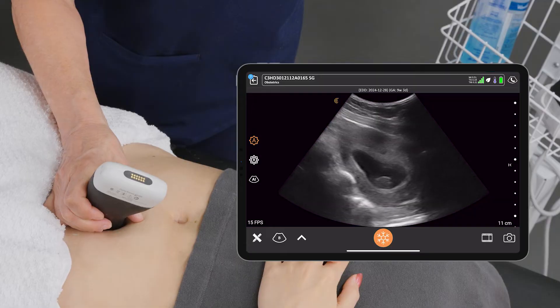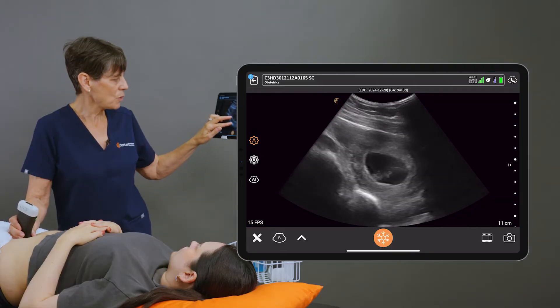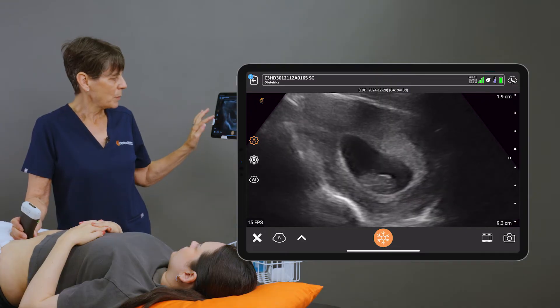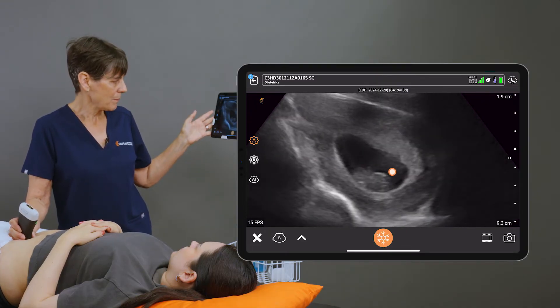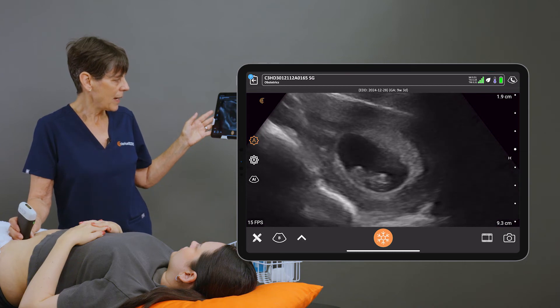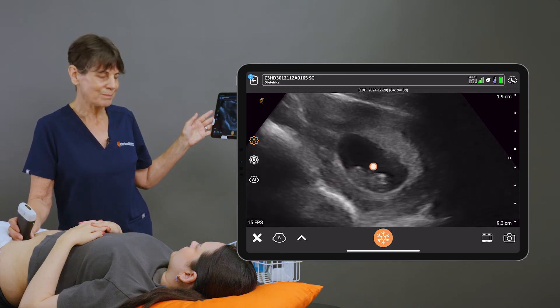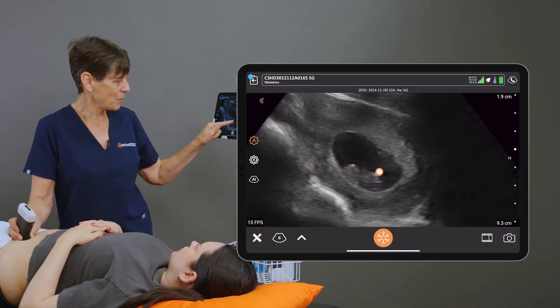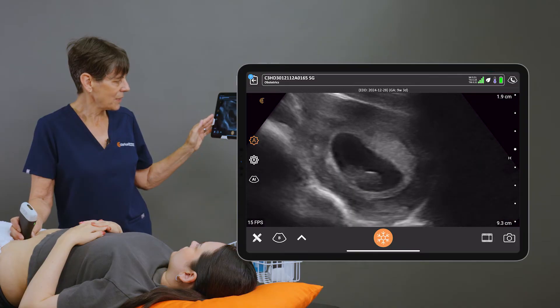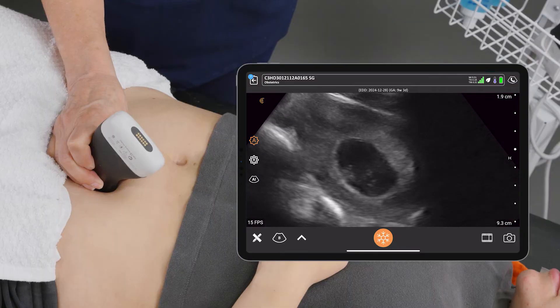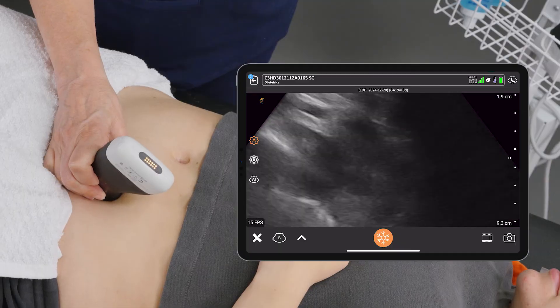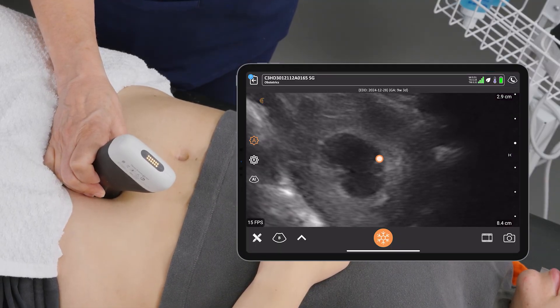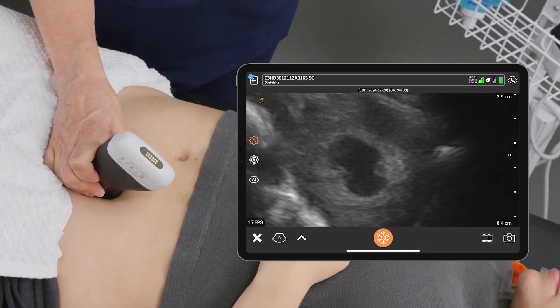Now looking at the contents of the gestational sac, I'm going to zoom the image. The black area is the fluid around the baby, and we can see a little fetal pole there — a little embryo — the head end and the rump end, and we can even see little fetal cardiac activity. Scanning through that gestational sac, we can also see a tiny yolk sac, which is normal at this stage of the pregnancy.